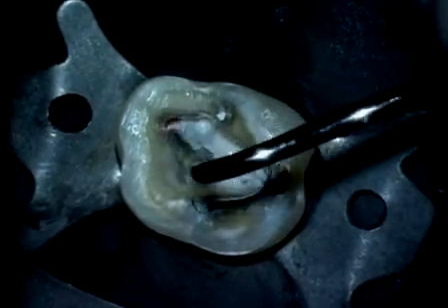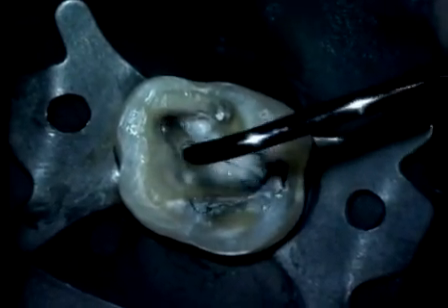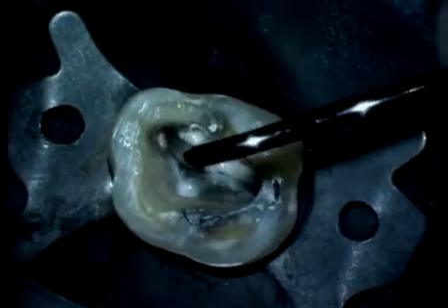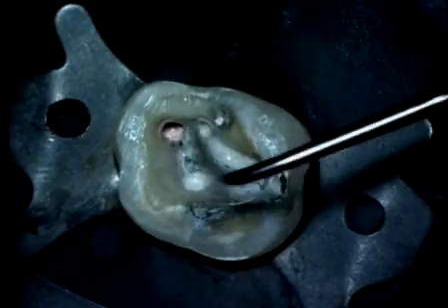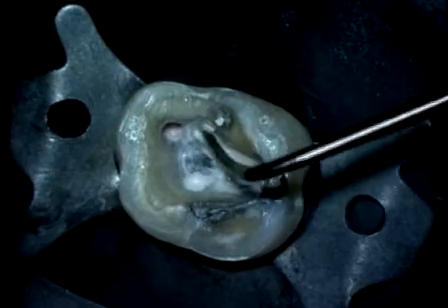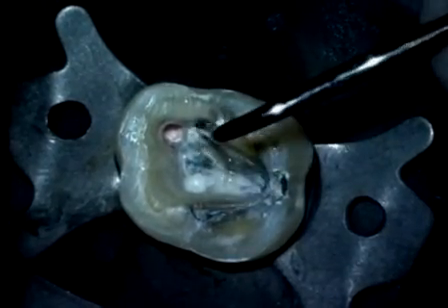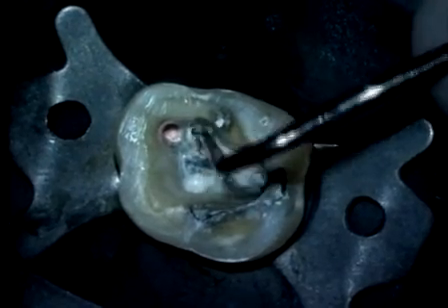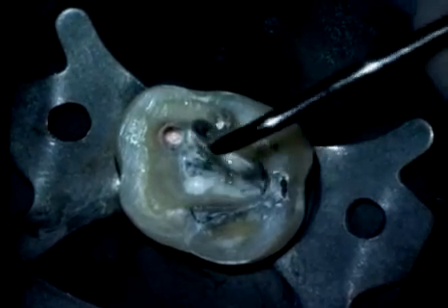Utilizing a smaller pre-fit plugger, step it circumferentially around the canal to capture the maximum cushion of rubber. A sustained press for 5 seconds fills the canal laterally and in depth over another 3 to 4 millimeters. The touch and heat now plunges into the MB2, where it effectively pulls out gutta percha. This allows our smaller plugger to work passively, unrestricted by dentin, and again we're carrying a wave of warm gutta percha progressively deeper into the root canal space.